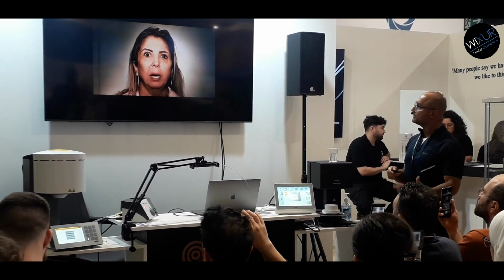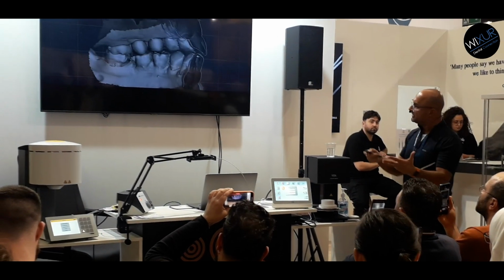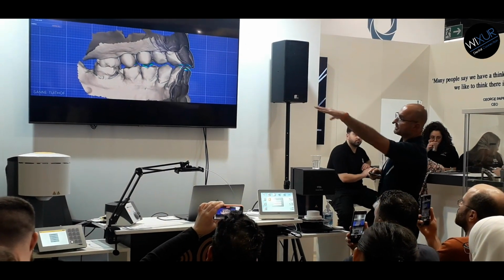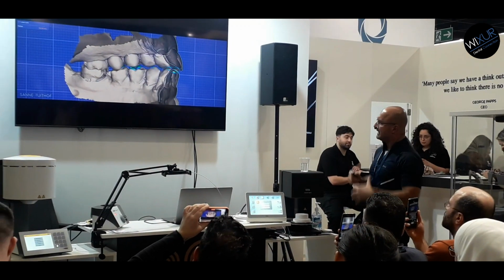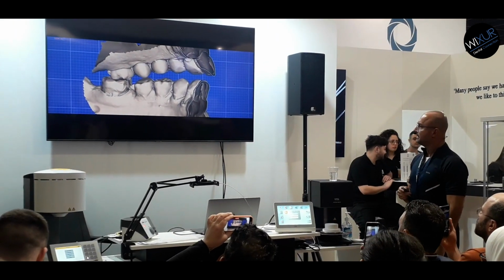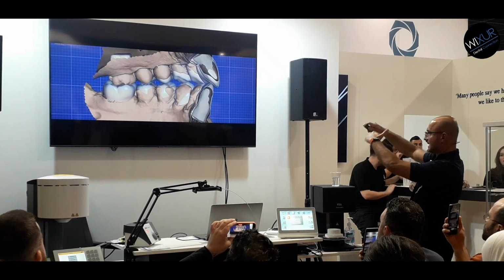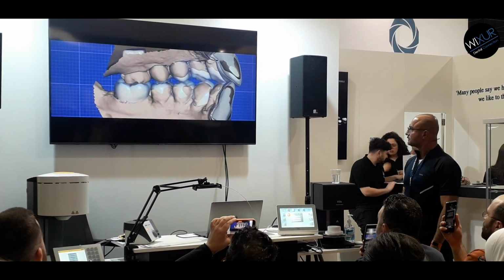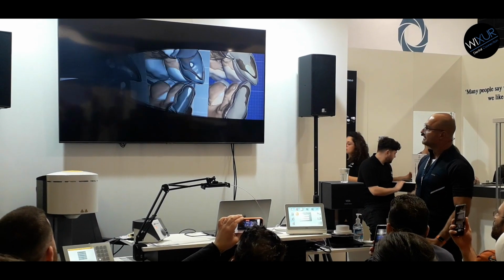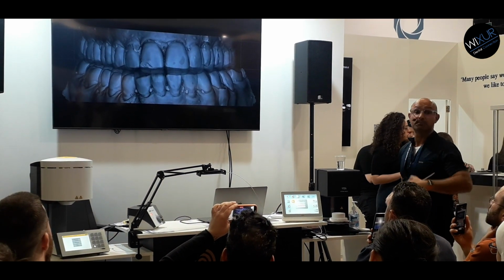So we let the patient count from 60 to 70. And now I do the final adjustment. I open the bite. Posteriors, I keep as small, as close as possible. And I do the wax-up digitally. I love these pictures because you can cut it through and see how the freedom is. So the final design. And now she can grind down and prep everything.